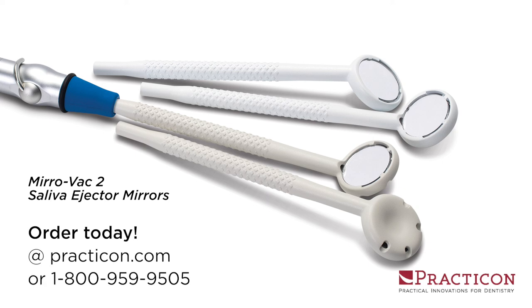Lightweight, disposable, powerful. With single or double-sided mirrors, that's Miravac 2 saliva ejector mirrors — another practical innovation from Practicon.